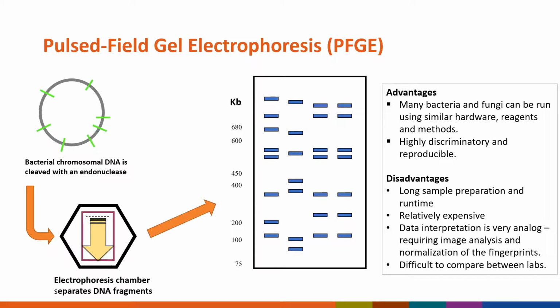This is a platform that can be used. You can use similar hardware, reagents, and methods to study many different types of bacteria and fungi. It's very discriminatory and reproducible, but it is very hands-on. It requires a lot of specialized user time. It can be relatively expensive.